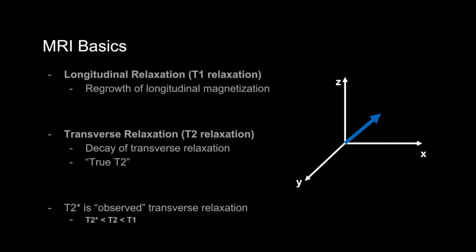Any magnetic field inhomogeneity will result in some protons that experience higher field strengths and others with lower field strengths. So the ones that have higher field strengths precess faster than the other ones. If that happens, then, of course, there will be a resultant loss in signal in the transverse plane very quickly because the transverse magnetization depends on precession remaining in sync.